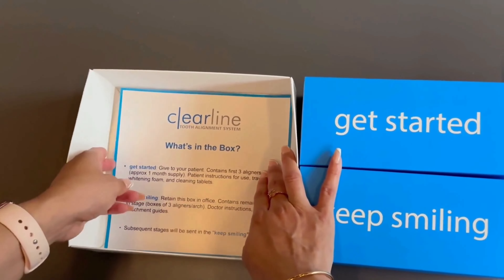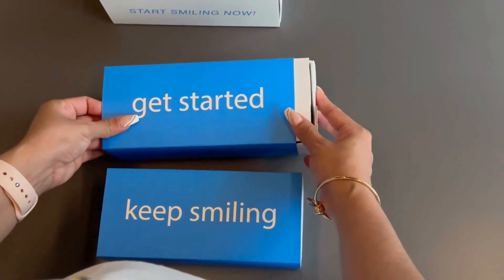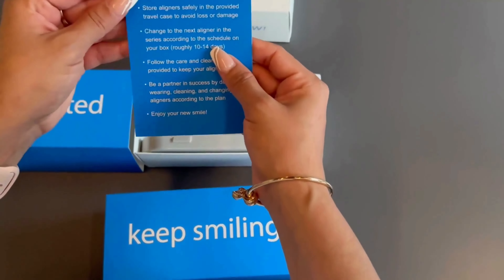There are also instructions to describe what's in the box. The Get Started box contains everything your patient needs to begin treatment, including instructions to help guide them.